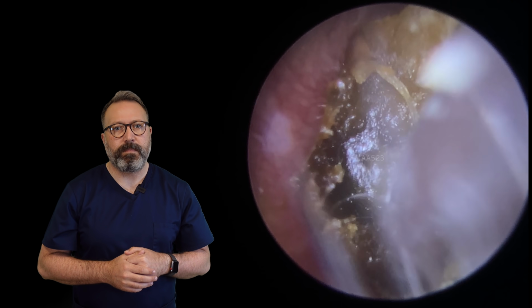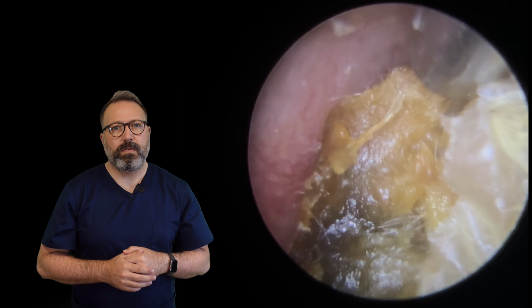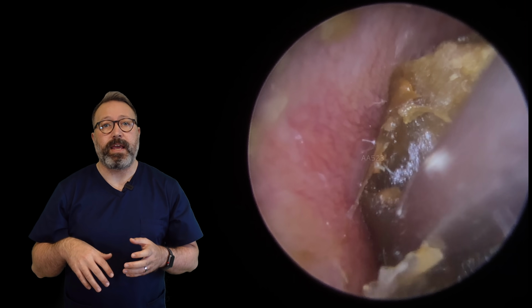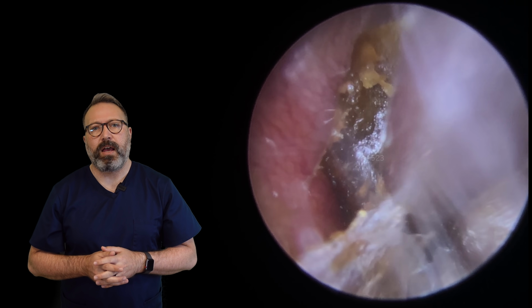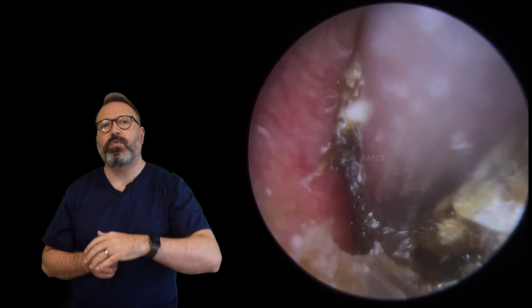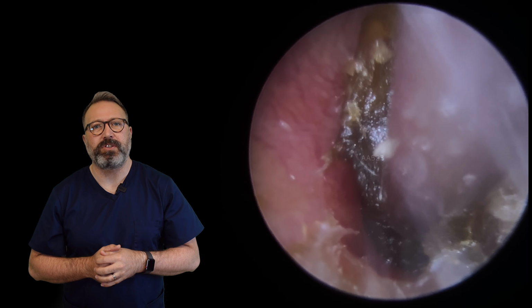Let's lift up from the base again here. You can see that long strip of dry skin to the right-hand side there. That keeps folding down in front of the wax, which can cause a problem, especially if it folds all the way across. It can be a bit more problematic because that piece of skin then will constantly be flicking in front of what you're trying to lift up. But you can see this is firmly wedged in here.